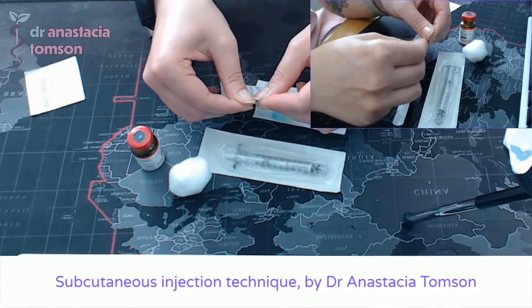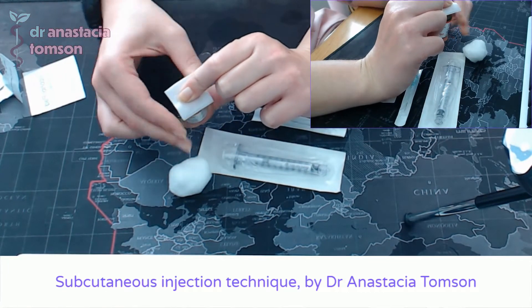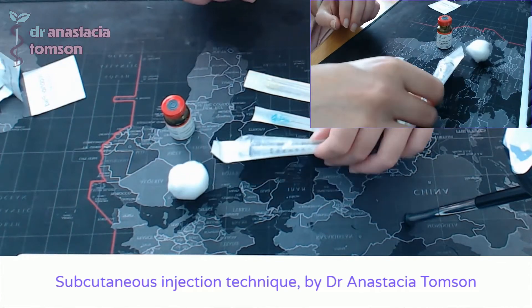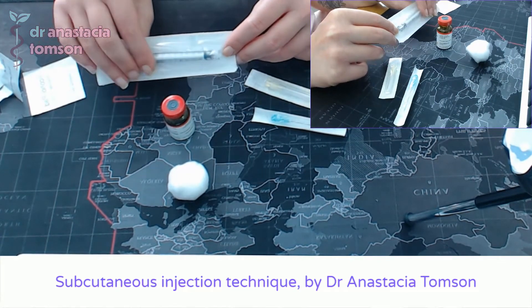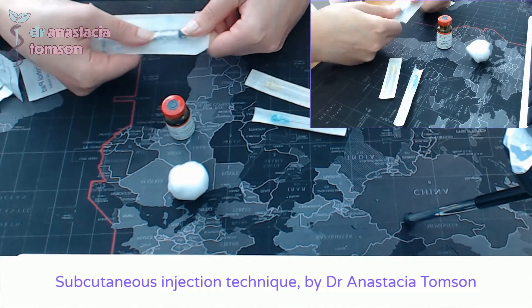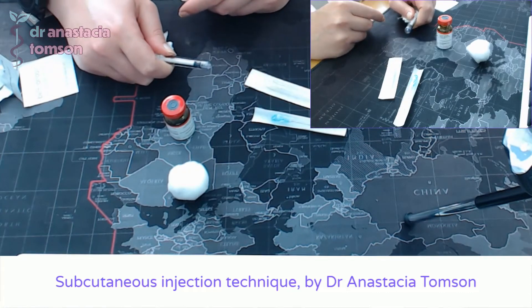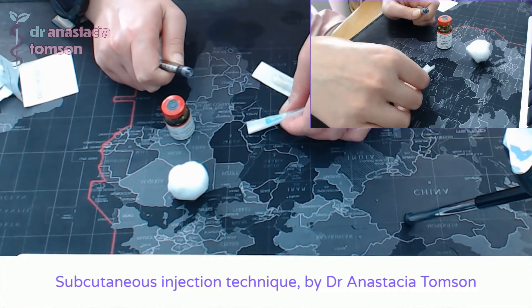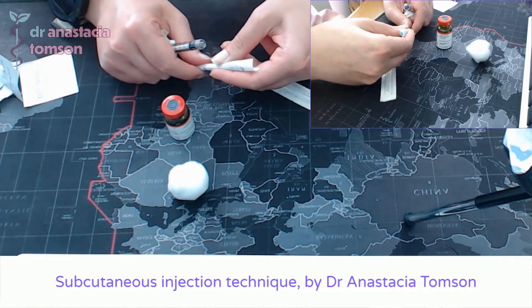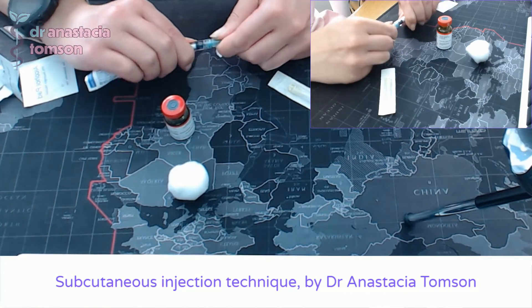I'm going to clean the top of my medication vial by tearing open the alcohol pad, pinching it against the vial, and giving it a twist — nice and clean. Then I'll take my syringe package, push the connector end through the back of the paper, peel it like a banana, and hold it firmly in my hand. I'll do exactly the same with the needle — push the connector end, the colourful piece of plastic, through the back of the paper, and then attach them together by screwing them in.